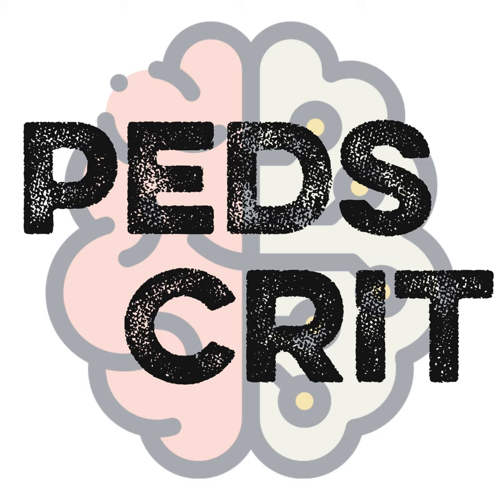So this seems so important. Let me try to read back what I understand. You let me know if I have it right. So we have this patient who has an arterial cannula going to the femoral vessels. It's pumping in oxygenated blood at a high pressure. That's going to increase afterload to the left ventricle.